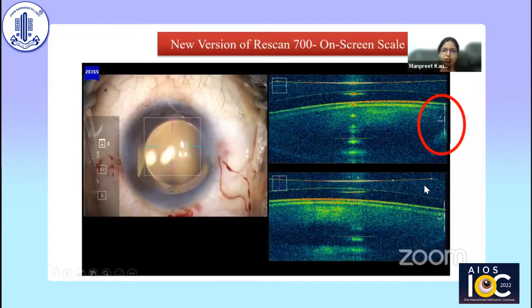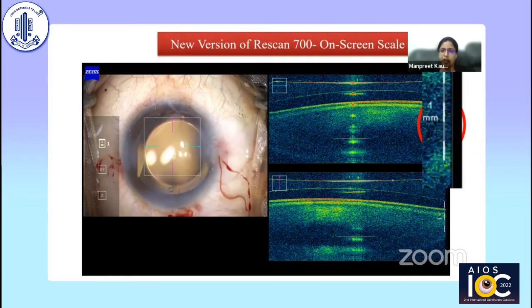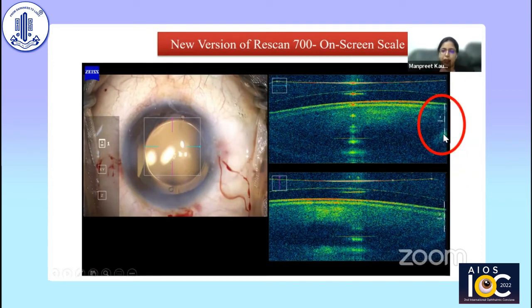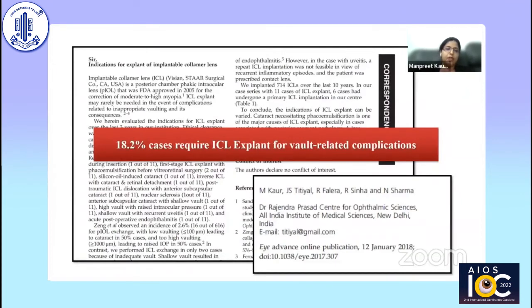The newer version of Rescan 700 has an on-screen scale of 1 mm (1000 microns) with five boxes, each corresponding to 200 microns. This can be directly used to assess vault — measure one small box in millimeters, and it corresponds to 200 microns using a unitary conversion system to get the on-table vault. In our series, 18.2% of cases required ICL explant for vault-related complications, a significant decrease compared to a prior study where 100% of explants were vault-related, demonstrating enhanced safety with newer models and investigative modalities.